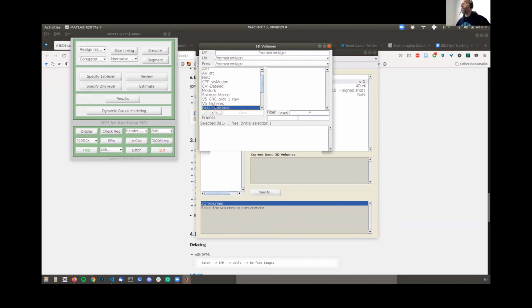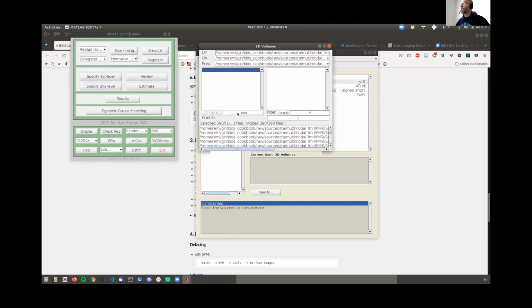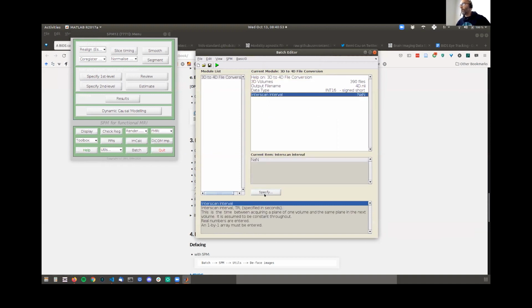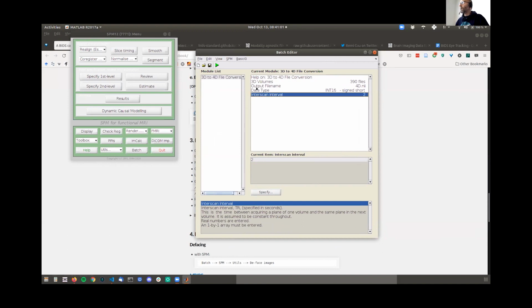It's in here, and for the functional data there were 2 sessions. You select all the files because this is what's called a 3D format, where each image from your time series is a different file. The interscan interval, which is your repetition time, I remember from memory is 2. Then you just convert the file.